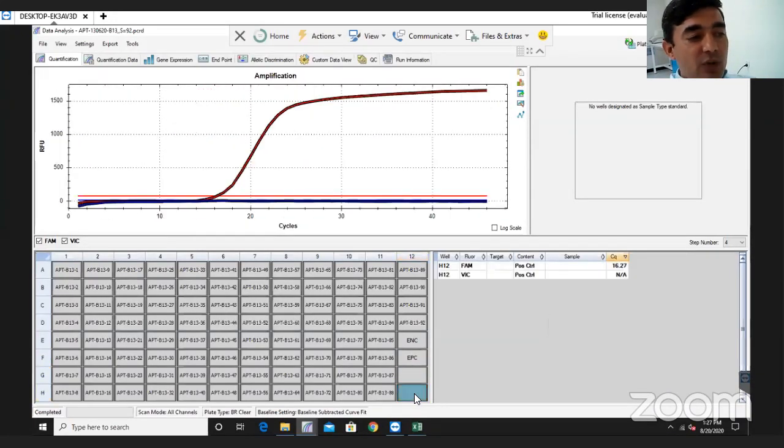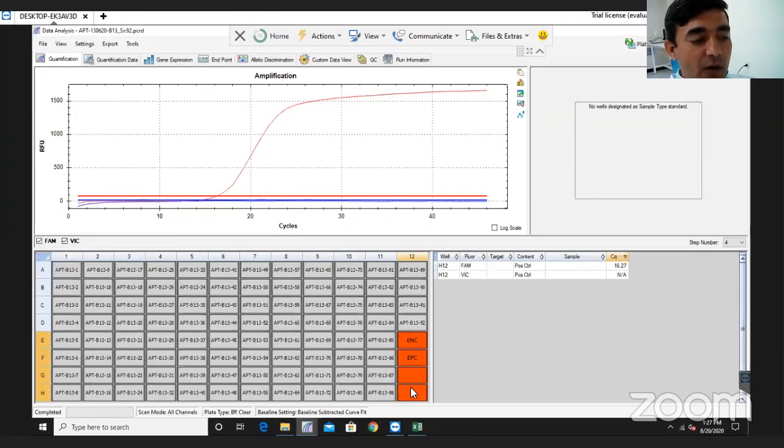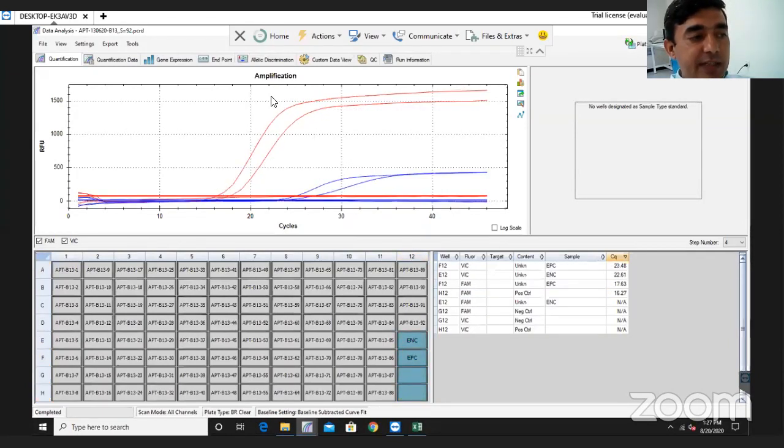While here is the positive control, this is only the PCR positive control. No extraction will be present over here because we did not put any extraction. So this is the positive control sample of the RNA process. So initially, all of these four wells which we selected are basically giving us information about the controls, whether our particular PCR batch is valid or not valid. All the information comes from these four samples.